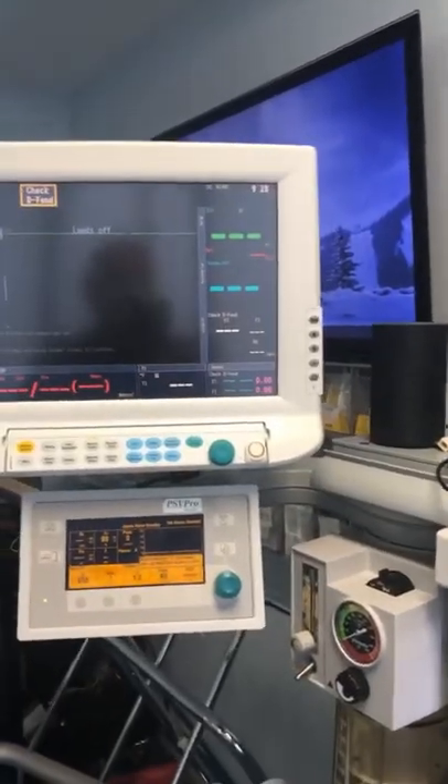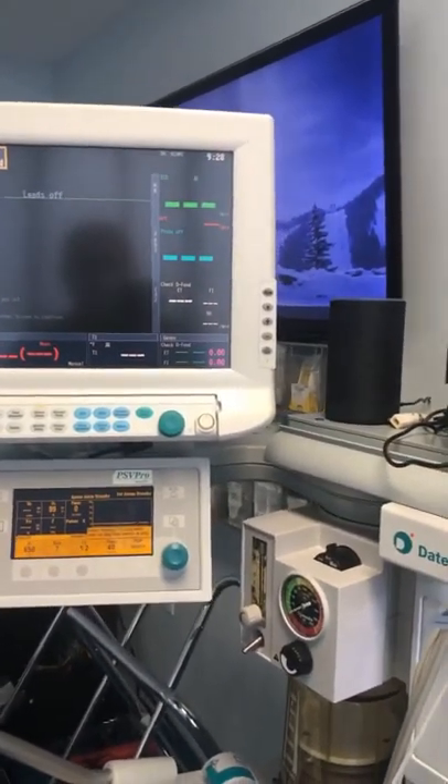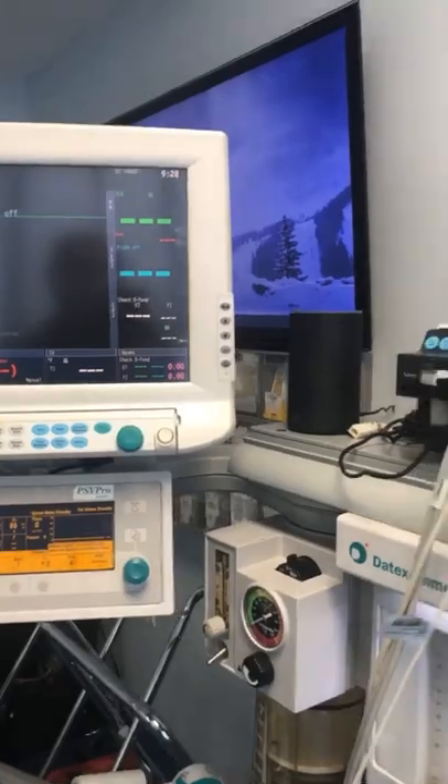Anyway, I had a special request this morning. Somebody asked if I could show what my morning setup ritual is like, and I'm going to try and do that as best as possible. So here's my machine — I have an Estiva machine, and it's somewhat basic but it's pretty nice.